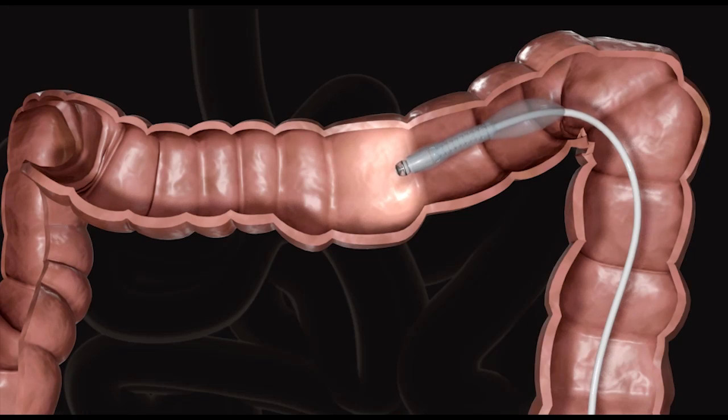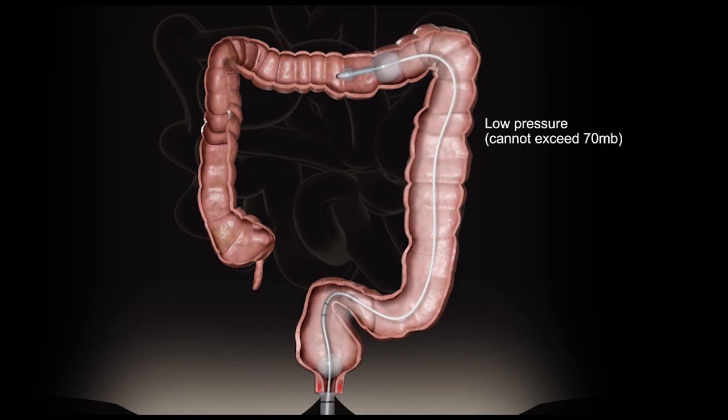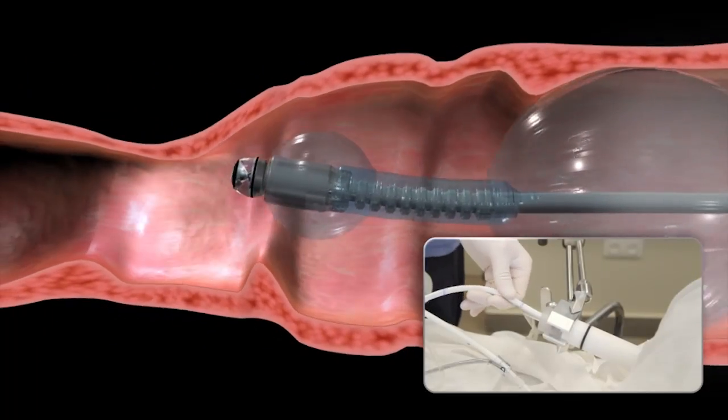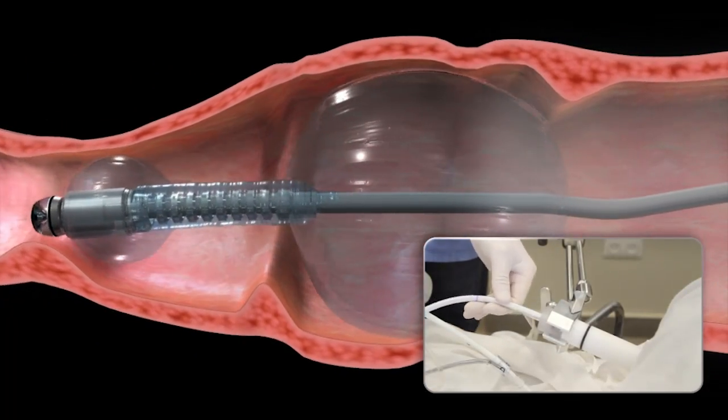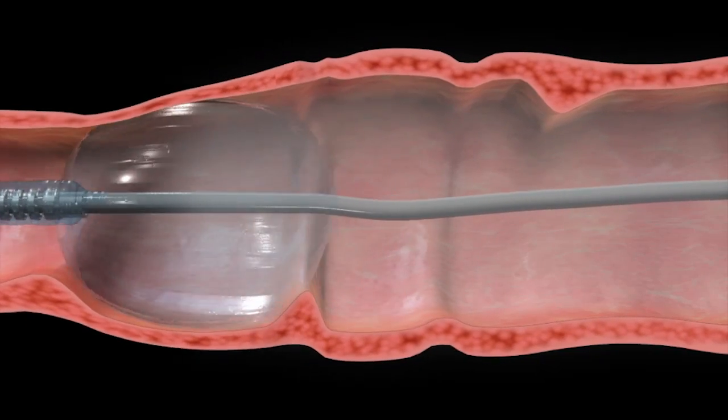The scanner balloons are inflated and CO2 fills the space between the rectal balloon and the scanner balloons. As the balloons are gently pushed through the colon by the operator, and with the aid of CO2 pressure, their diameter and shape are constantly adjusted to suit colonic anatomy.